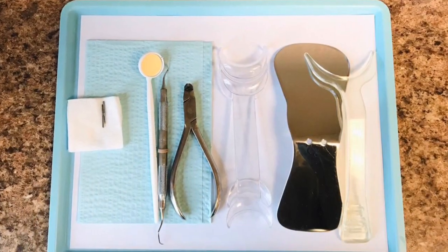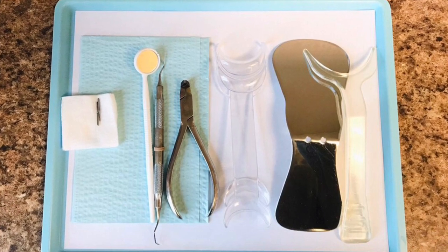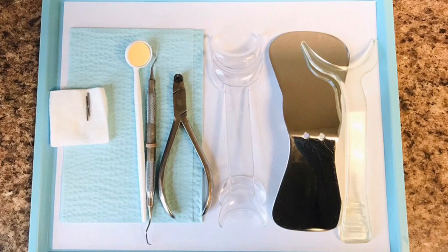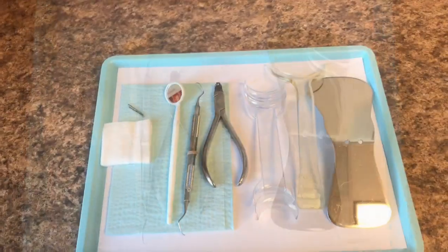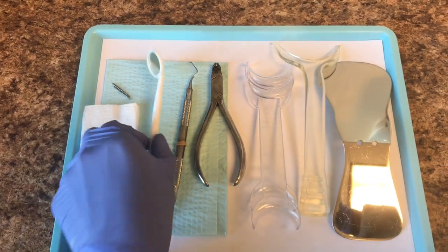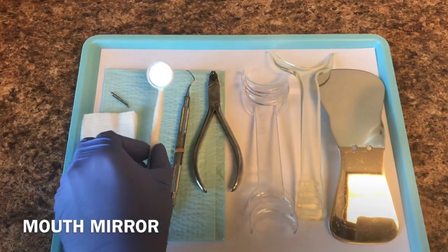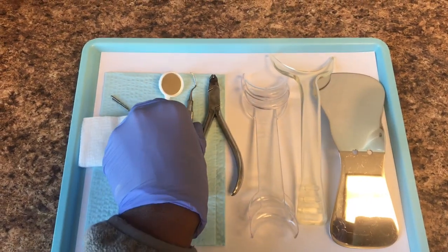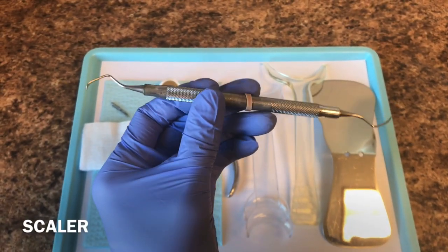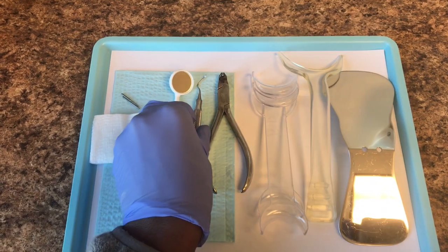So here we have your de-bond tray. De-bond means you'll get your braces removed, and this is the tray that we'll use when we take the braces off. So we have your mouth mirror. We have a scaler here, which is just used to remove any plaque that's underneath the brackets or in the way.